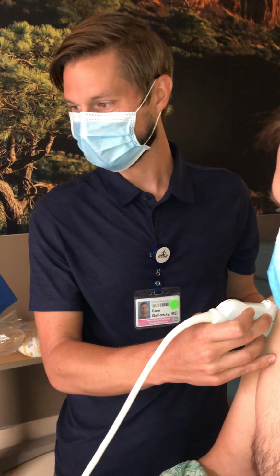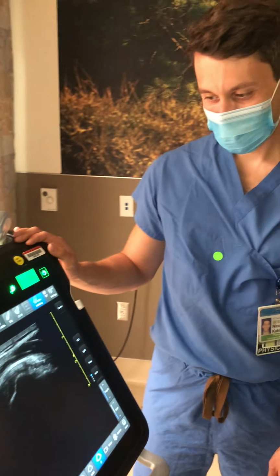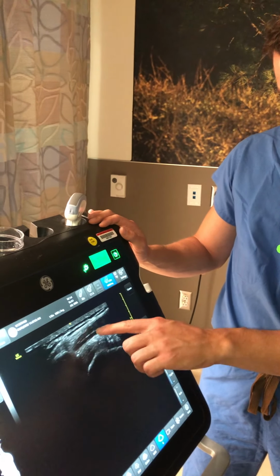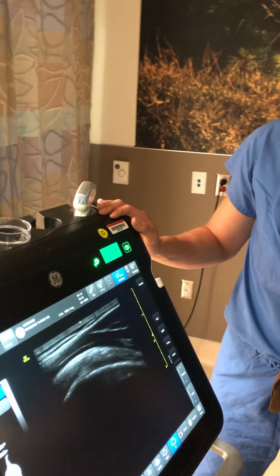So then we're going to come back up here. So that's our view of the biceps. You can follow it all the way up to where the biceps tendon dives more intra-articularly, and then you're going to lose the more proximal portion of the biceps tendon.